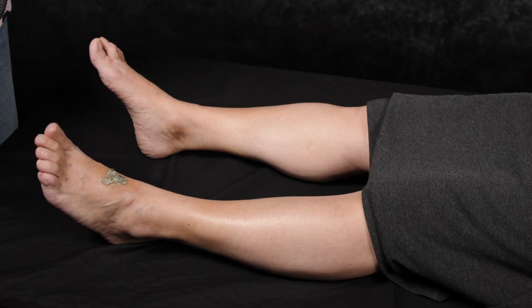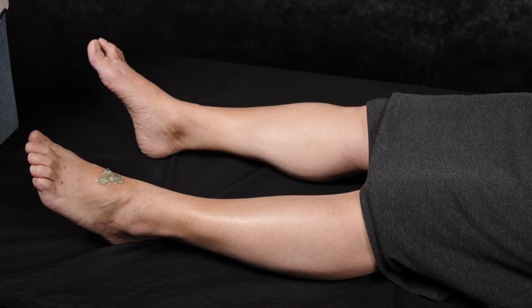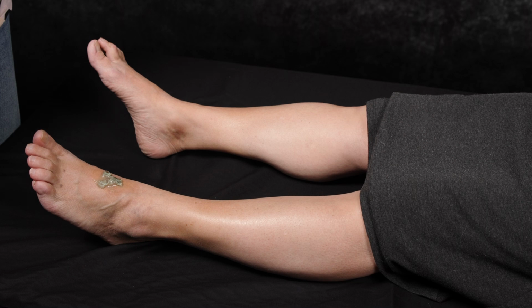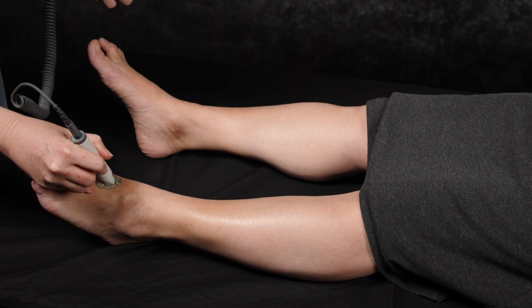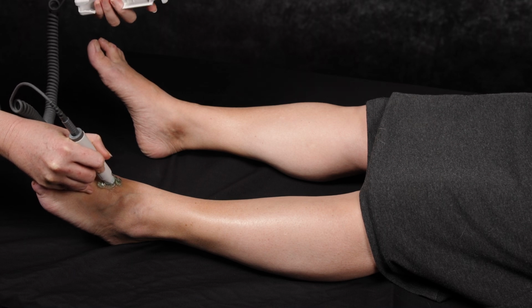Okay, so the first pulse I'm going to examine is the dorsalis pedis pulse. It's located on the top of the foot, around the middle section of the foot. I've already palpated that with my fingers and found that it was present. So now I'm going to put my Doppler in the gel. I've put lots of gel on, as you can see, and I'm going to try and find a signal. I can hear a clearly biphasic signal, or two sounds. 1, 2, 1, 2. And I'm also listening and looking at the same time.